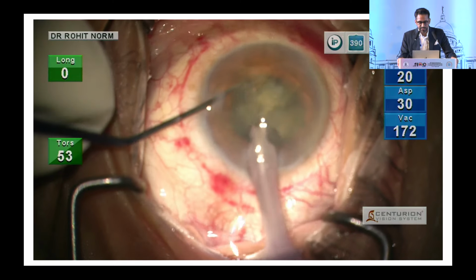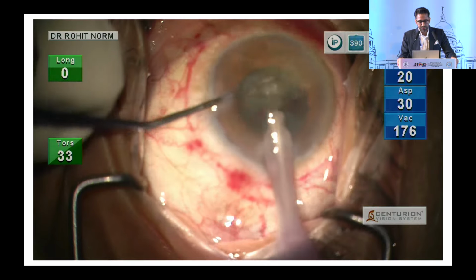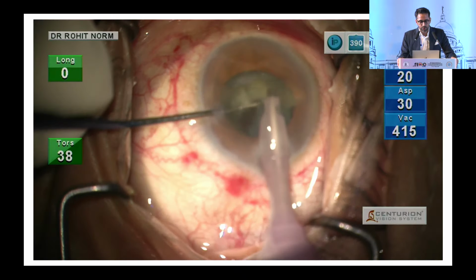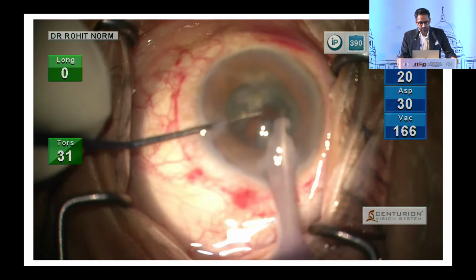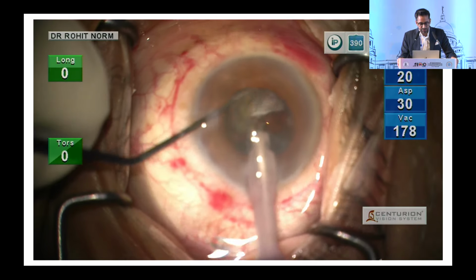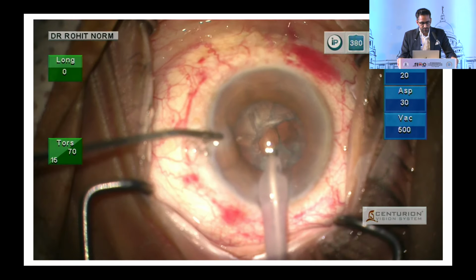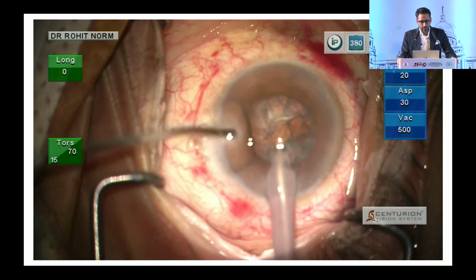epinuclear sheet, a scaffold, which is providing a good shield to the posterior capsular defect, and it helps me continue phacoemulsification safely. You can see there is no peaking of the pupil, no drawing of vitreous to the tip as well, and the hyaloid phase was intact. Inject viscoelastic before taking out the probe.